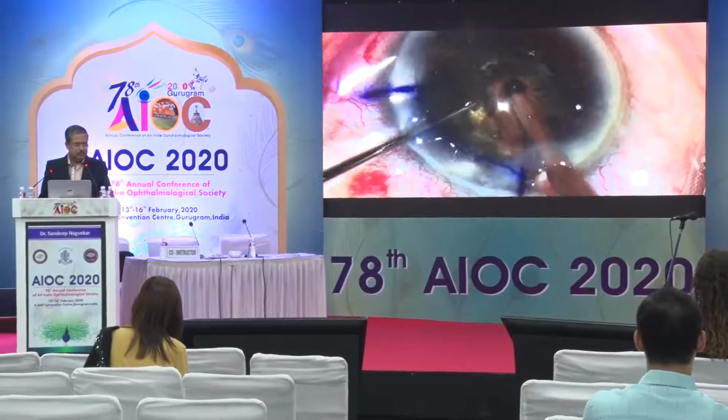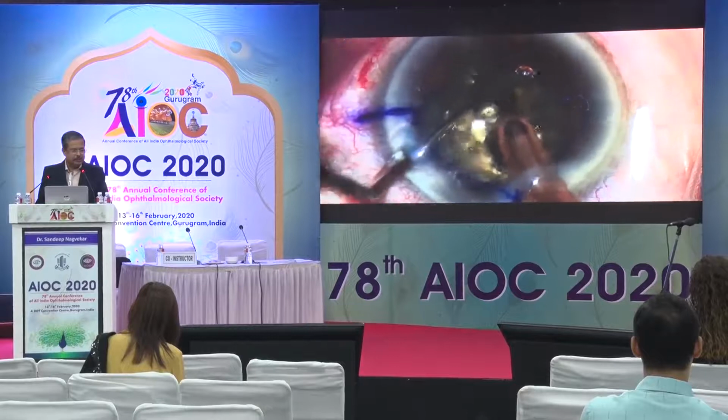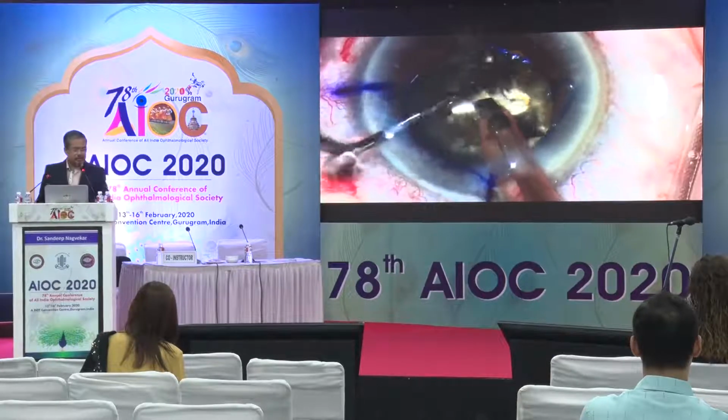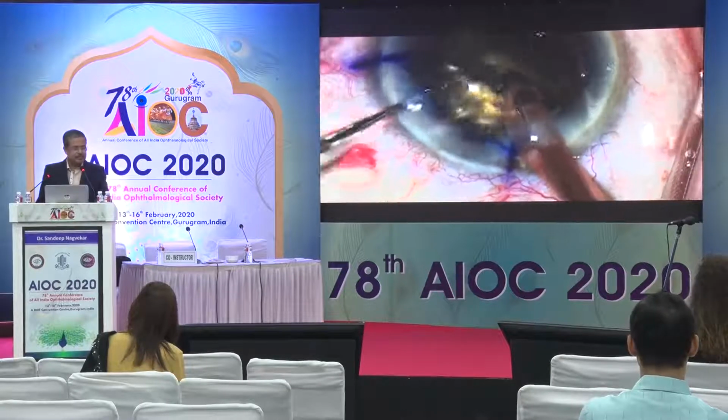Again, as you can see, those leathery fibers, you go deep down to the base, and then of course ensure that the separation takes place. Now, I just heard the bell, so in the interest of time, I will move over this case, which is more or less a repetition of that.